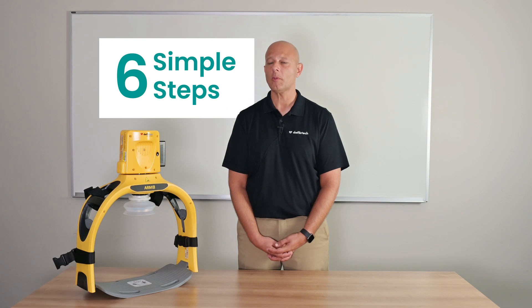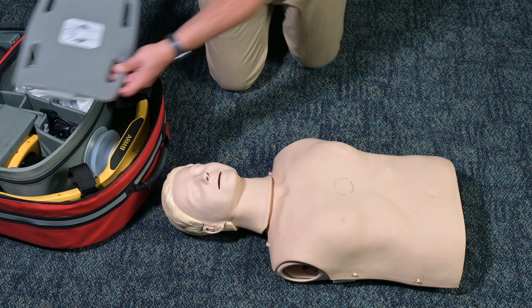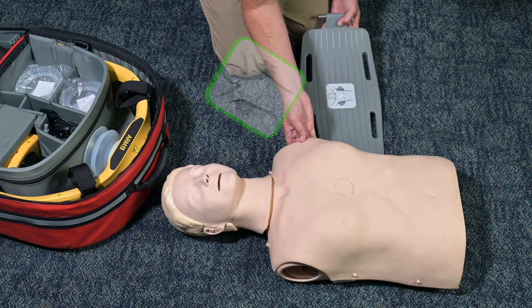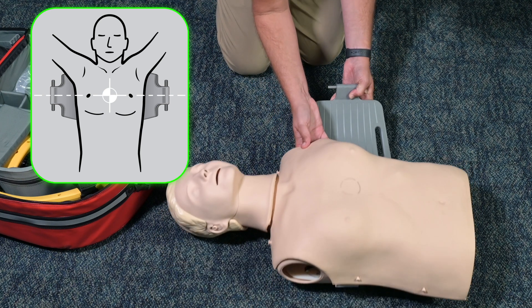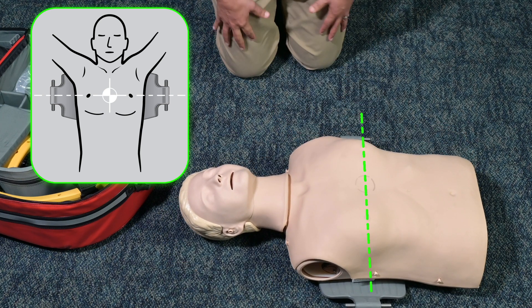There are six simple steps you will perform when using the ArmXR device on a patient. Once the backboard is removed from the carrying case, you'll place it under the patient, center to their chest, aligning it with the patient's nipples as indicated on the backboard graphic.